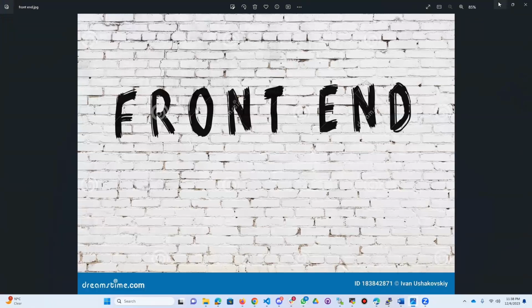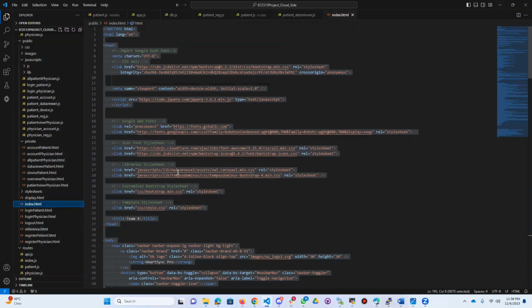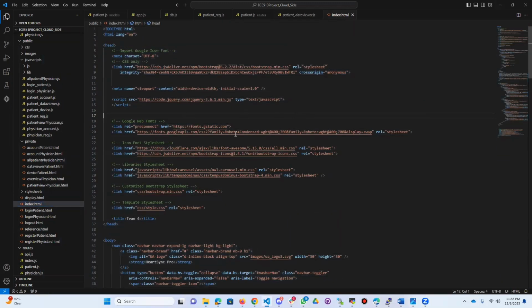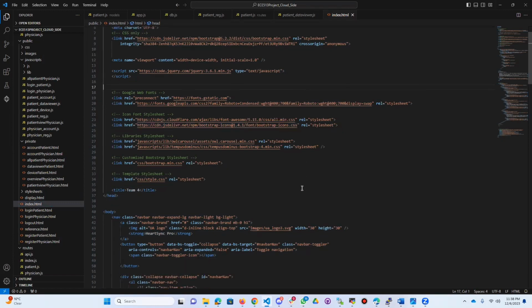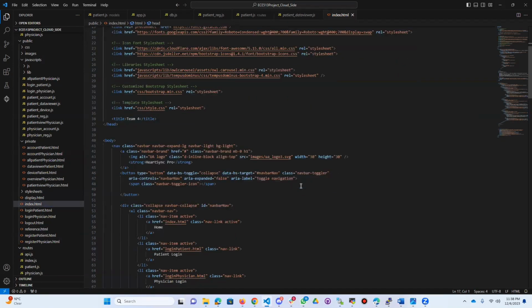Okay, so the front end, the main file is the index.html. Here you can see this HTML document serves as the main web page of our project. It uses the Bootstrap framework for design consistency and responsiveness. Okay, what does responsiveness mean?